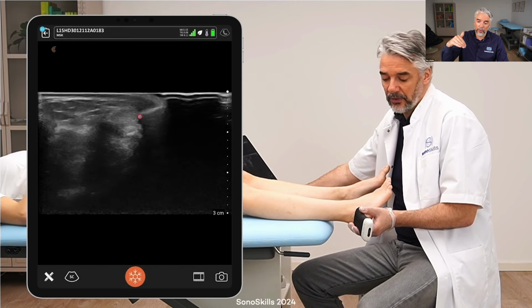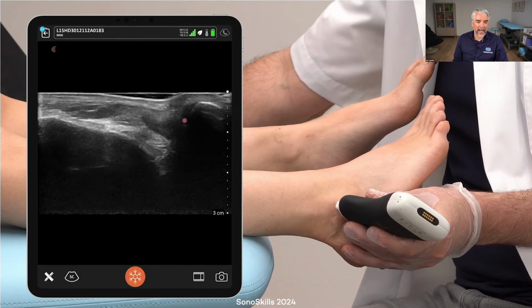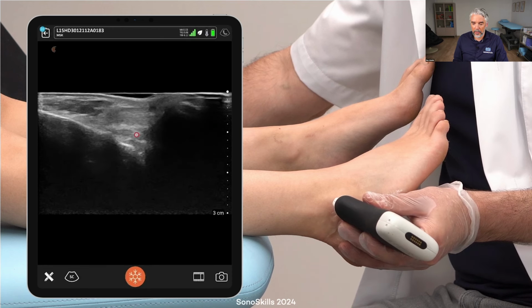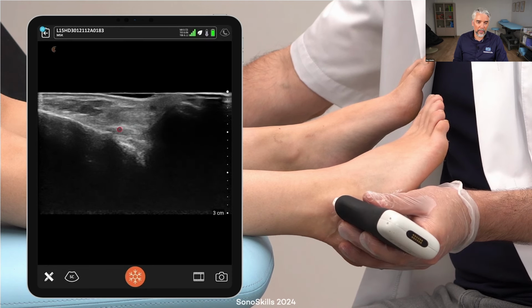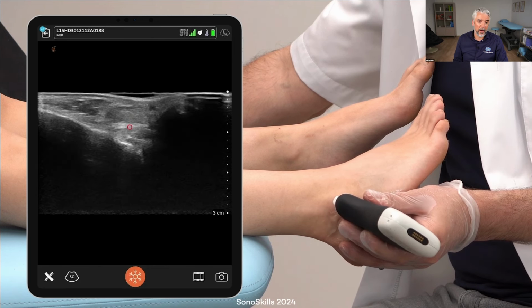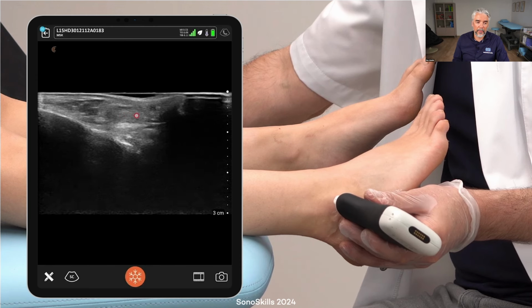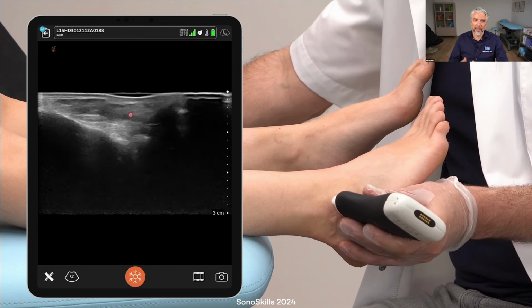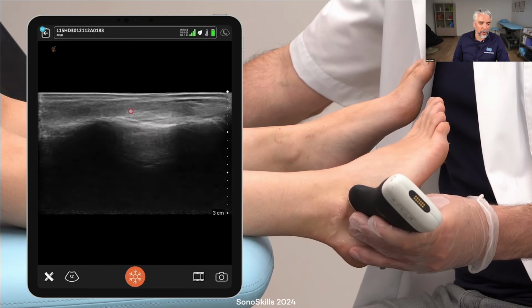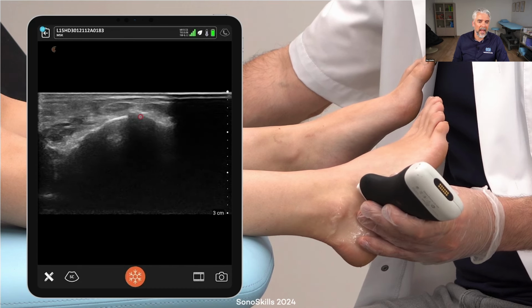From there on, we're going to circle around the ankle joint, and we're going to scan the peroneals near the calcaneofibular ligament. This is the ligament right there, and on top of the ligament, we can find the peroneal tendons. With stretching of the ligaments under ultrasound guided examination, you can let the peroneal tendons bounce on the ligament, then you know that the ligament is intact.